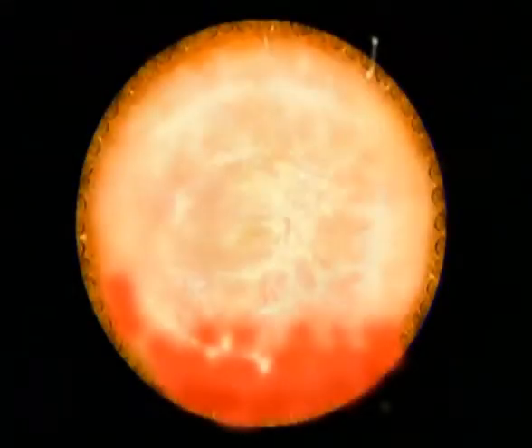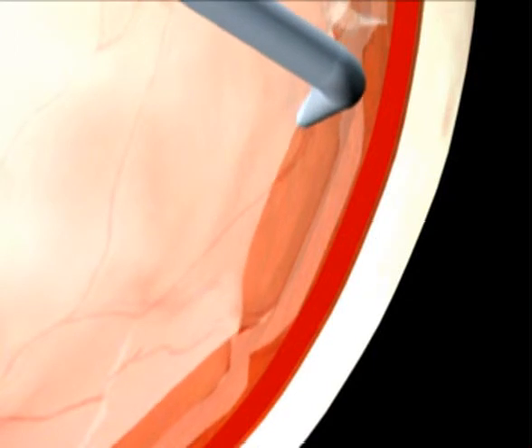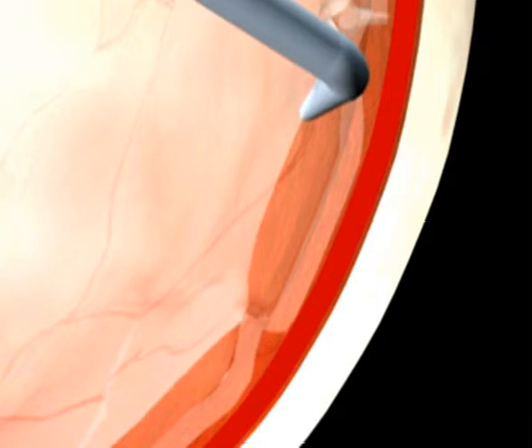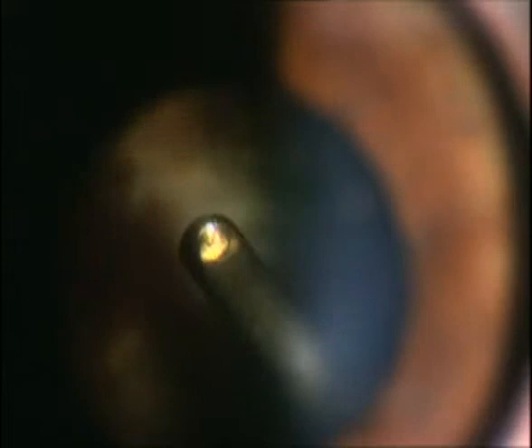In a third configuration, the adherent proliferation is everywhere up to the periphery. There is not enough space to separate the dissected tissue from the vitreous base. In addition, the dissection between two strong adherences is dangerous because, unlike the optic disc, the retina can tear under the effect of delamination. So I reduce then the opening of the port and remove the membranes with the sole help of my vitrectomy handpiece.